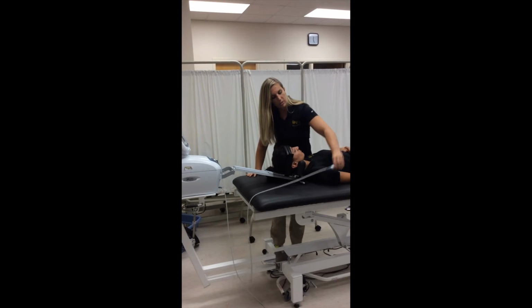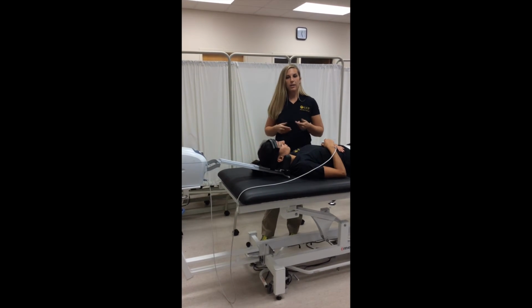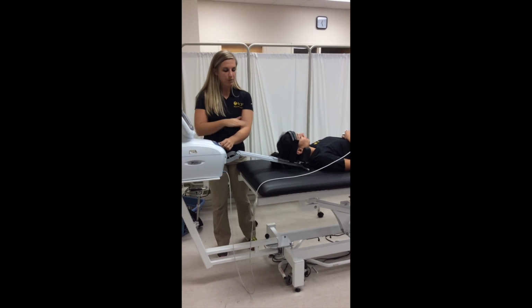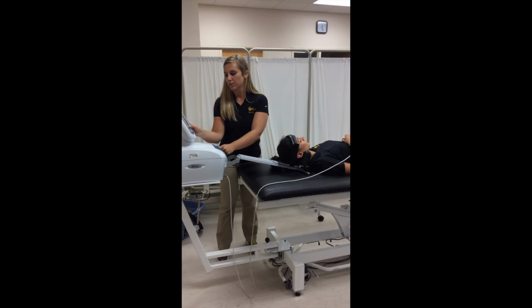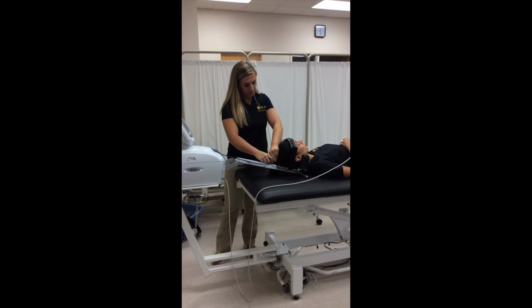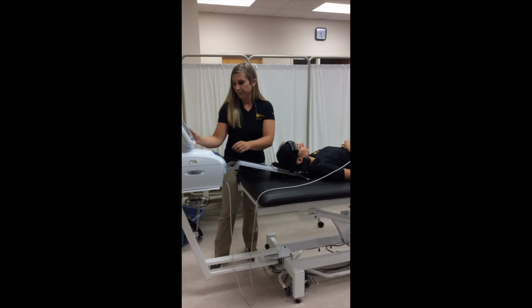I'm also going to make sure to give the patient the call bell in case she feels any discomfort or pain. She can stop the machine herself. I need to hook this up to the machine, so we're going to hit rope release. You hold it down to pull out the rope. You can go ahead and connect it, and then you want to hit it again to take up the slack.